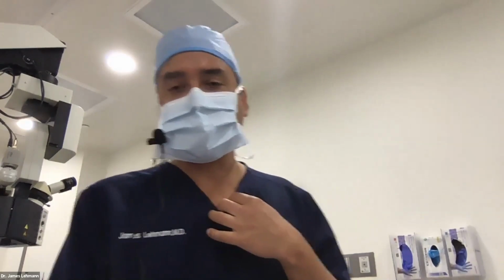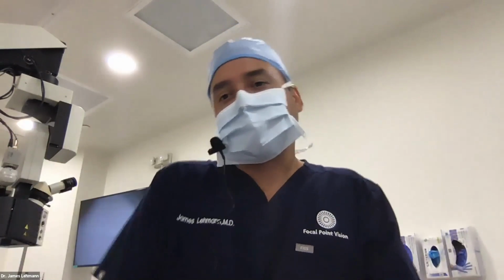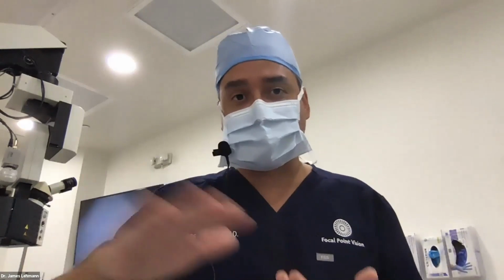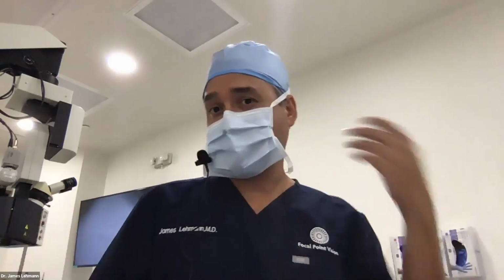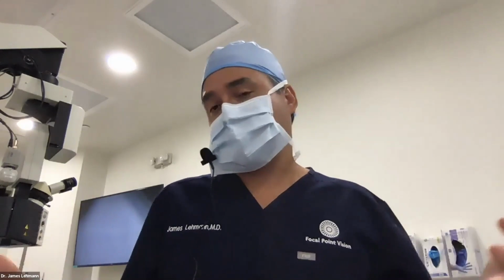Can you please compare temporal incision with superior temporal? Either way is fine. To me, temporal is the most comfortable. Hospitals in a lot of countries don't have stretchers or beds that'll make it easy for the surgeon to sit temporally. I think that's why most surgeons outside the US and Western Europe sit superiorly. But to me, in most surgeries you just have more room, right? The cornea is longer by 20% horizontally. So you just have a better view sitting temporally.